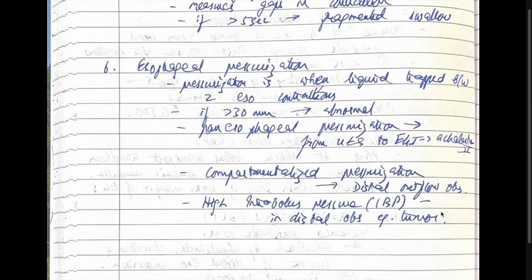Pan-esophageal pressurization is pressurization that is from the upper esophageal sphincter to the esophagogastric junction. This is achalasia type 2. Compartmentalized pressurization would be seen in distal outflow obstruction. High intrabolus pressure would also be seen in distal obstruction, for example in a tumor.